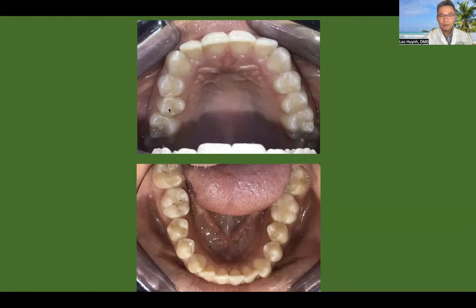Number 4 is lingually inclined compared to number 5, and as you can see, 7 and 10 seem to be distally and facially rotated right there, and that puts you in a situation where you can help the patient turn the teeth to align with the occlusal line angle. All of these have to be in one arch. So we'll see what we can do.